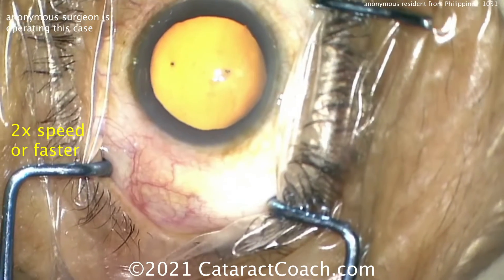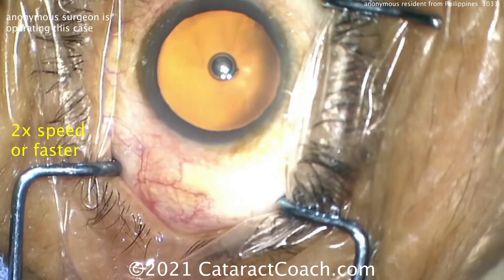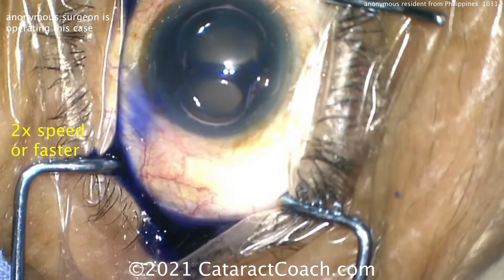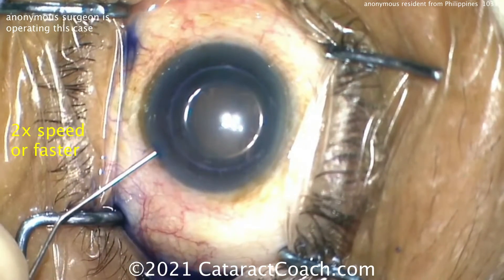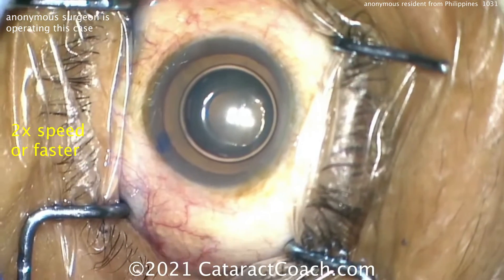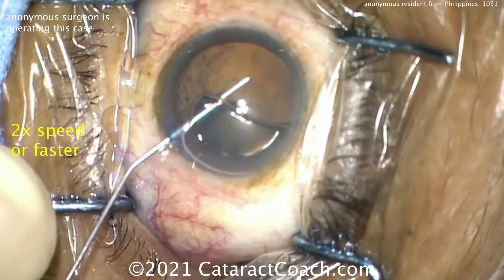There's the paracentesis. Looks like putting in some anesthetic inside the eye. It doesn't look like too dense of a cataract — a pretty reasonable one. A little trypan blue dye going in the eye; that's very helpful to use during residency training. In the US, keep in mind it's about $55 to $60 per dose and may not be reimbursed. There's our dispersive viscoelastic going in.